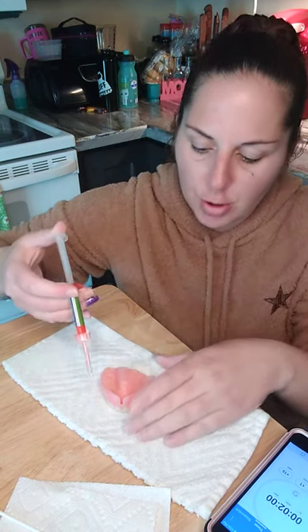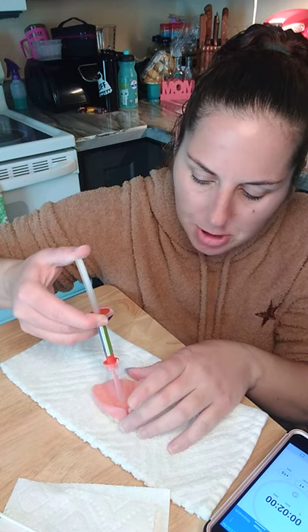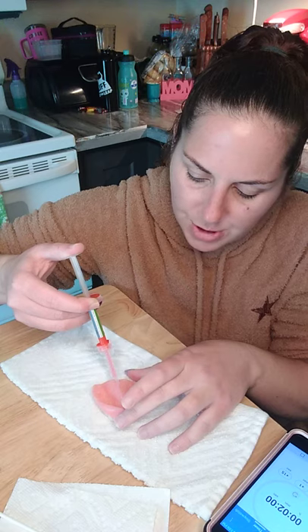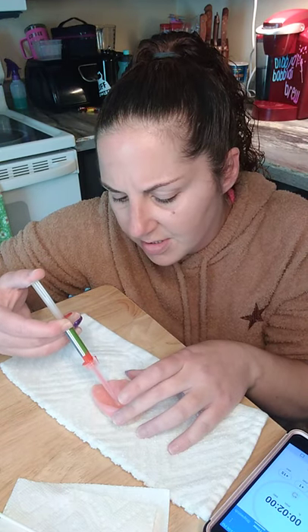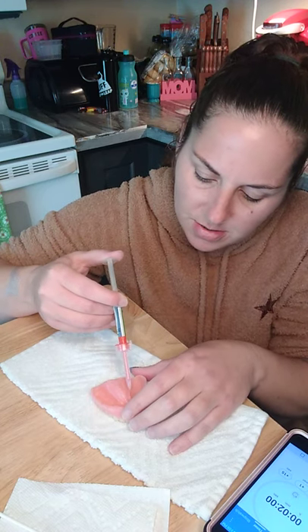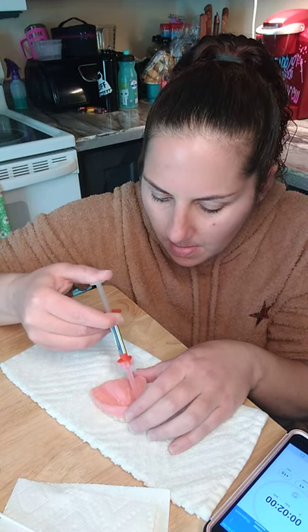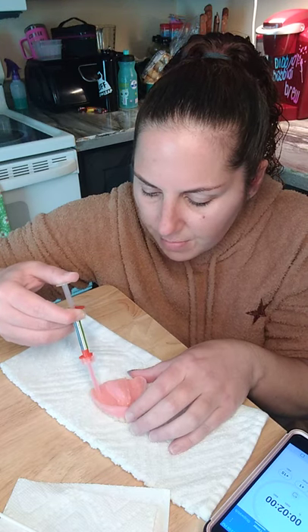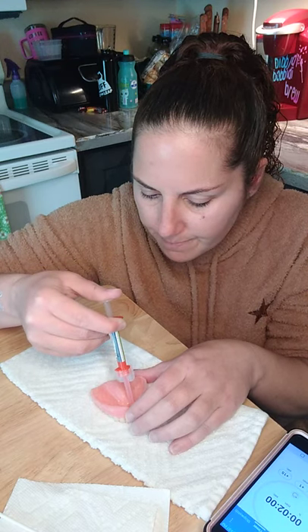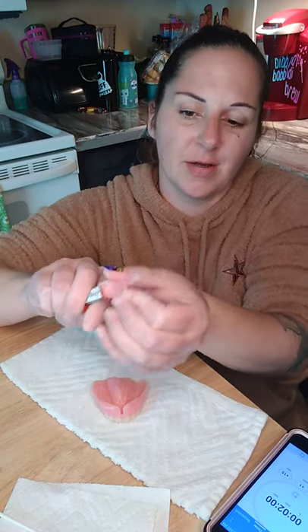So what you do is you want to hold it. I'm trying to get my hands not to shake. It takes a minute, guys. Take your time. Go slow. It takes a minute for it to go in the tube. And it actually works fairly easy. And you do the left and right side, just like I told you guys. Then you take the extra and put it in your trough. So I'm definitely probably going to have to add more. Okay, done. Finished it.